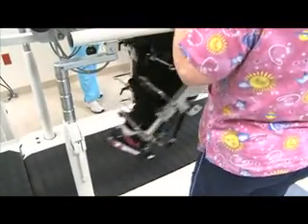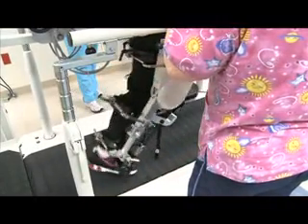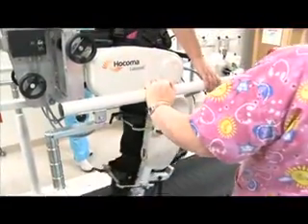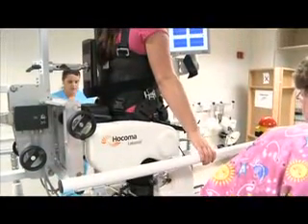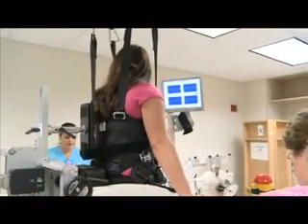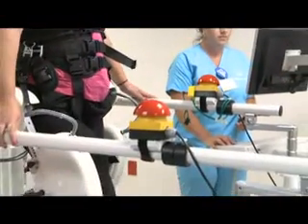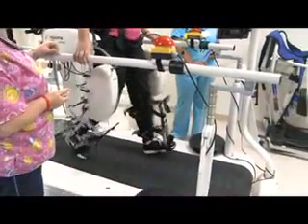We will tell you, as the therapist beside the patient, when to work harder or when you can relax and let the machine do it. There are safety stops on the machine. If at any time you feel uncomfortable or you feel like you need to be out of the machine, we can get you out. We also, as a therapist sitting beside you, will have what's called a telestop, which is a small button that we will push every 3 minutes to make sure that we stay with the patient. It's just a safety portion of the Lokomat that all Lokomat users will have to use.